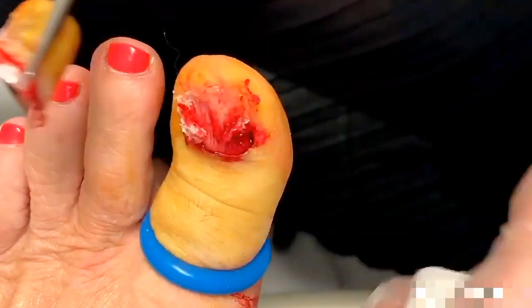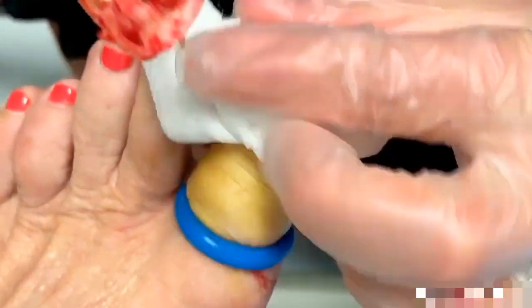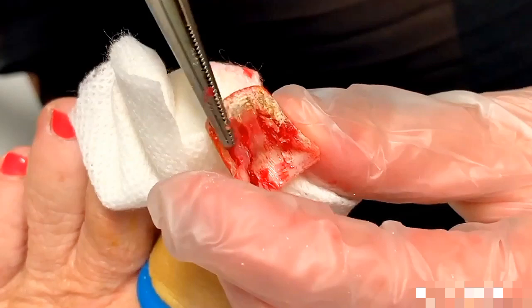Some of that tissue likes to hang on there. It's off. Everyone says that — they're like, that's it. So you can see here the fungus that's digging in. This was going into the nail bed itself.